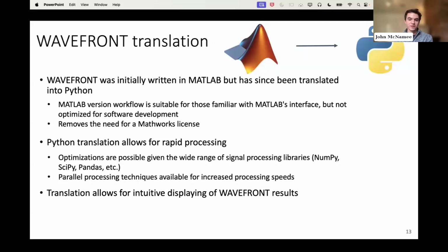Specifically, the GUI that I'll be presenting is built on a framework titled DearPyGUI, depending how you pronounce it. But ultimately, just the greater flexibility of displaying the results is another big motivation. So with that, you can go ahead to the next slide.